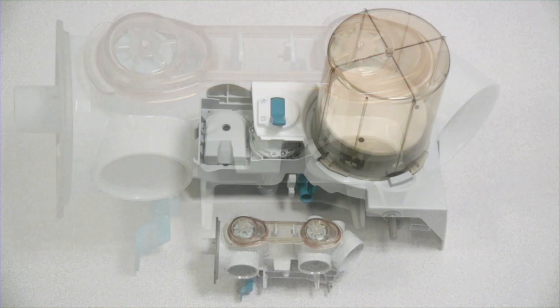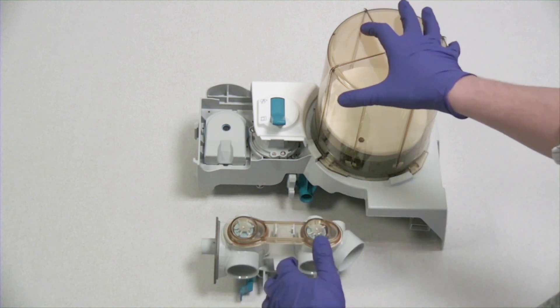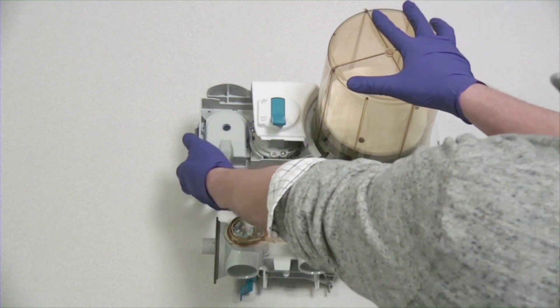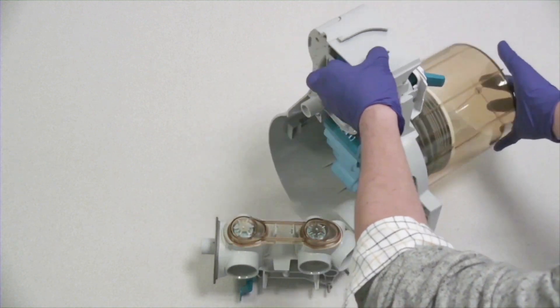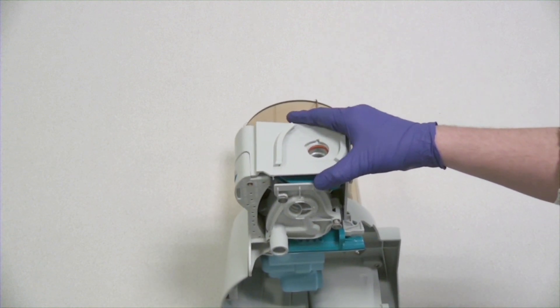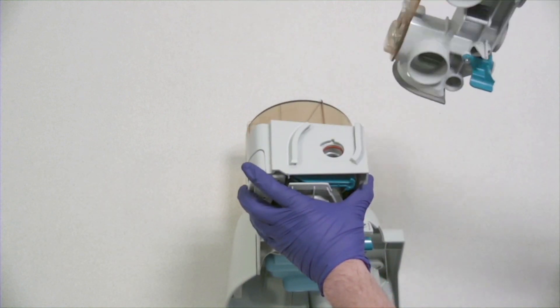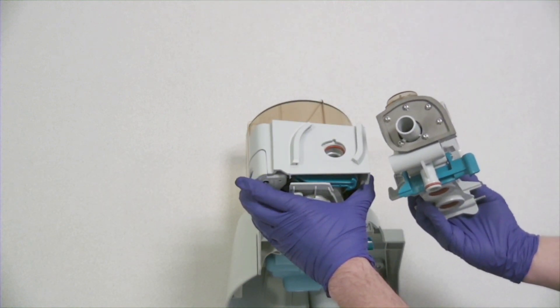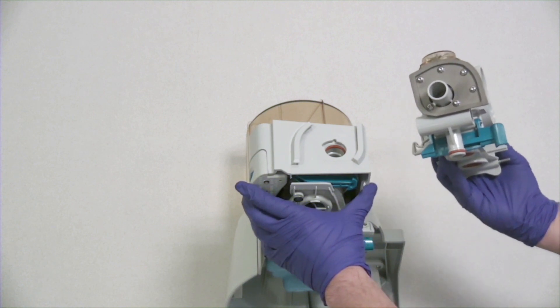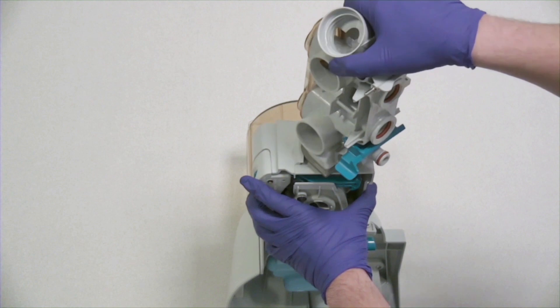To insert the breathing circuit module into the bellows assembly, an easy way to do this is place the bellows assembly on its side. It's easier to line up with the circuit module. You can see the little notches in the hole on the bellows assembly, which makes it easier to line up the circuit module itself. When they're lined up, slide the circuit module in and rotate it clockwise.